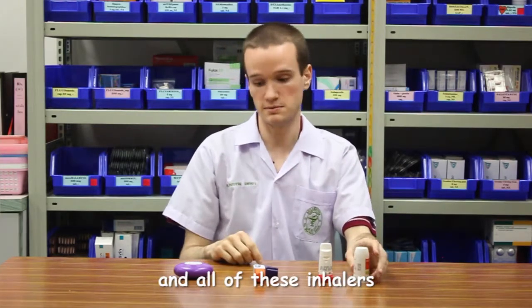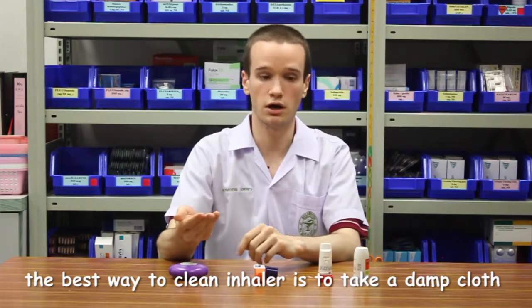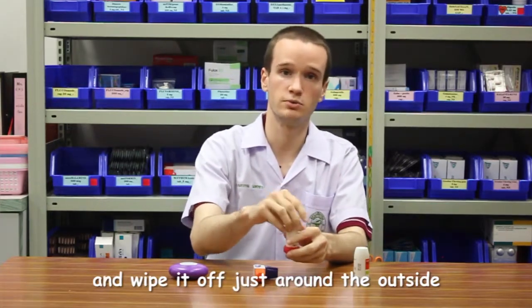And then for all of these inhalers, the best way to clean the inhaler is to take a damp cloth and to wipe it off just around the outside.